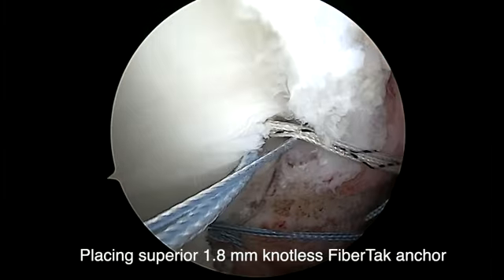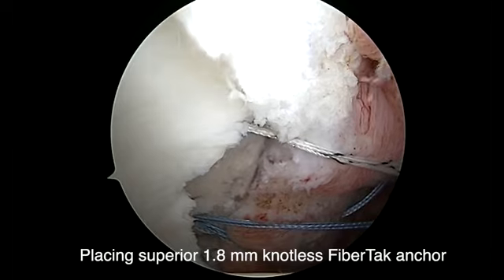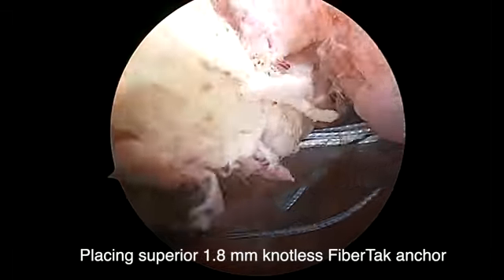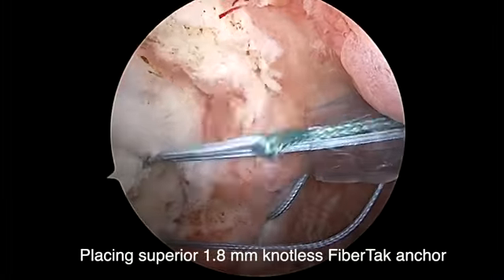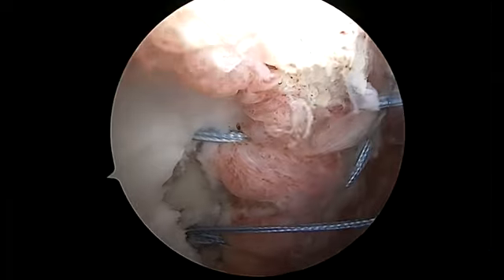The repair sutures of the two knotless fiber tack anchors should not be cut until the end of the procedure, as these may be sequentially tightened to provide additional reduction and compression of the posterior bony Bankart lesion.